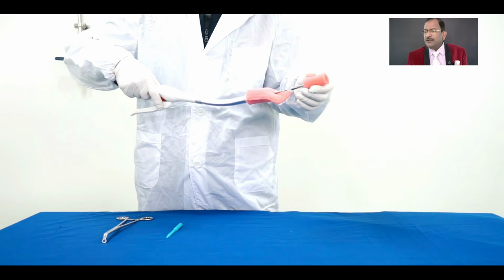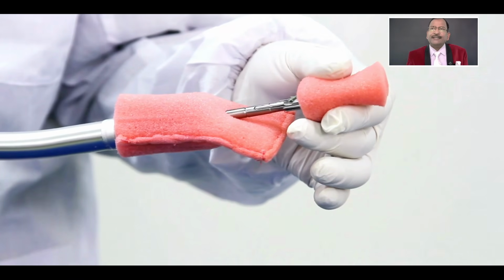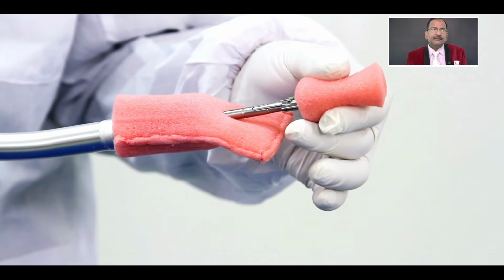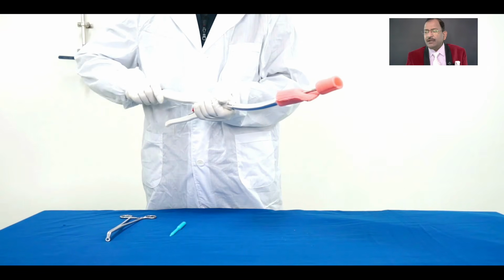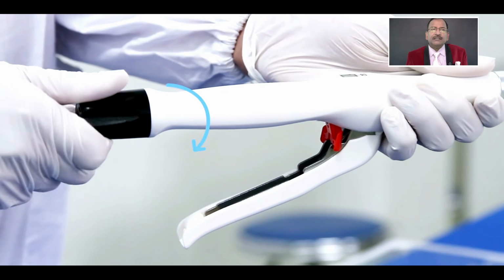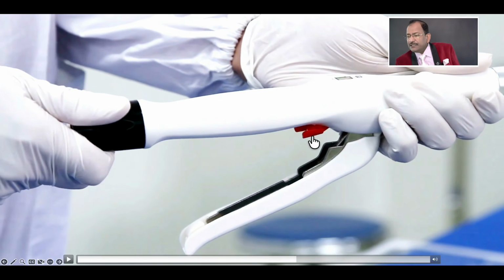And then the anvil will click, and there is a lock there, it will click. Once it clicks, it cannot detach easily. And then rotate it clockwise, and automatically the anvil will be pulled by the gun over the staple line. And once you reach there, this lock will open. Remember here, you will see I am taking a little back here.